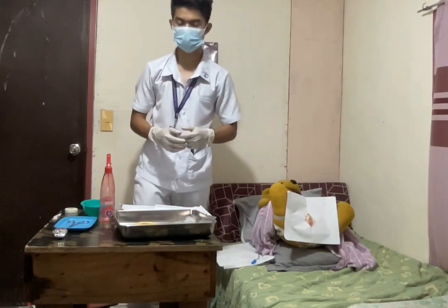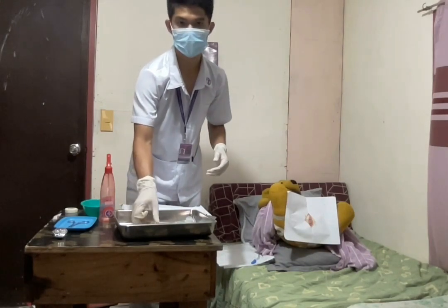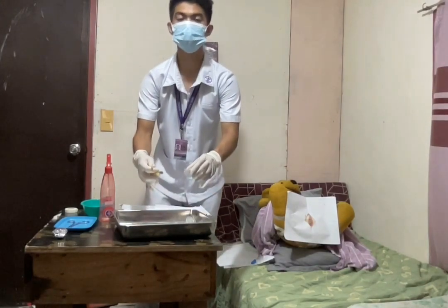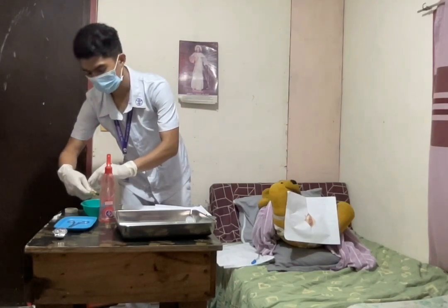Then next, I'm going to lubricate the catheter for about 1.5 inches, being careful not to plug the eye of the catheter. This is to facilitate smooth catheter insertion while preventing blockage.